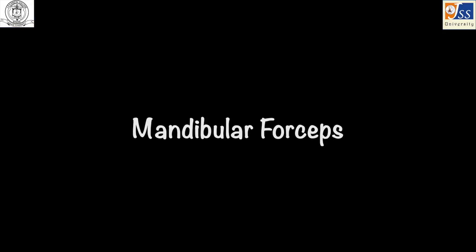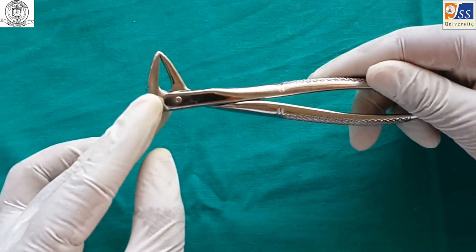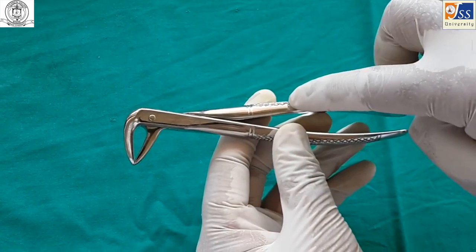Mandibular anterior forceps is used for the extraction of mandibular anterior teeth and sometimes for root stumps. In this forceps, the beaks are smooth and come in contact with each other.